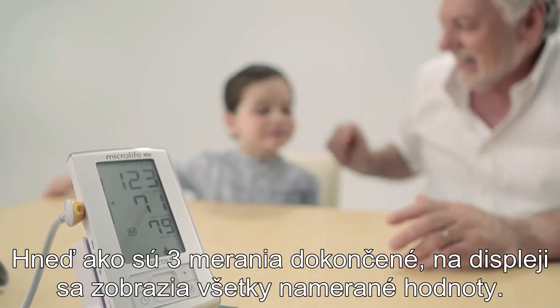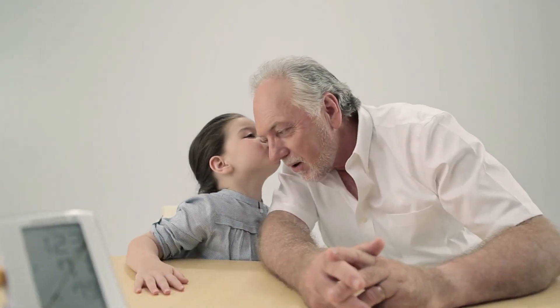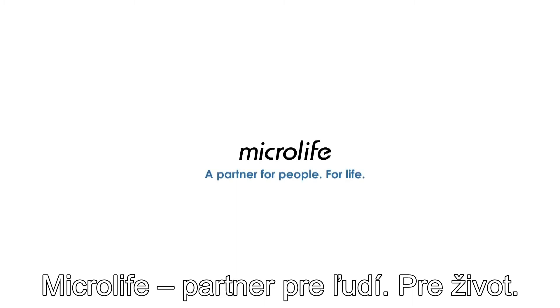Once three measurements are complete, the measurement data are shown on the display. Microlife — a partner for people for life.